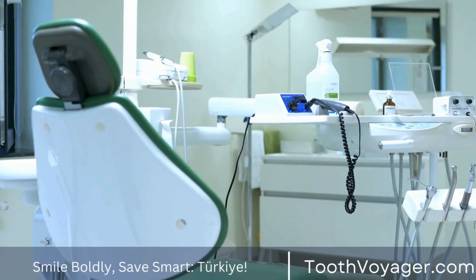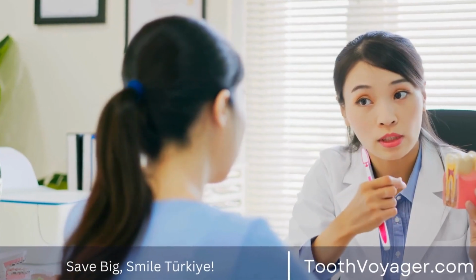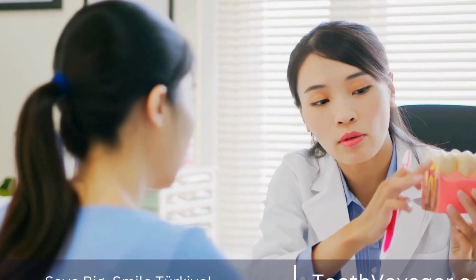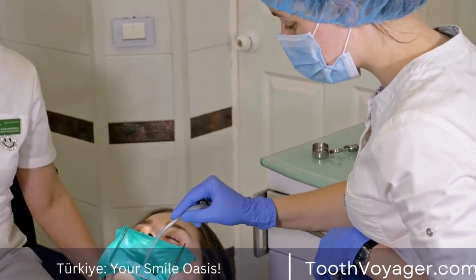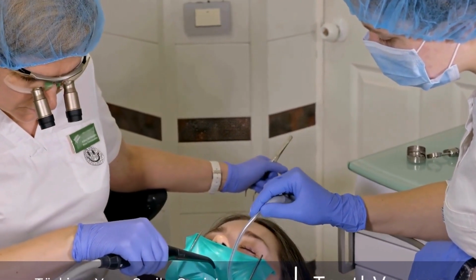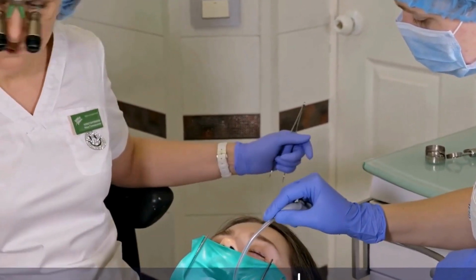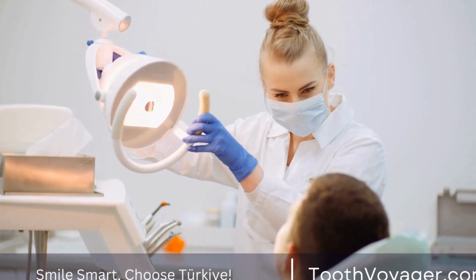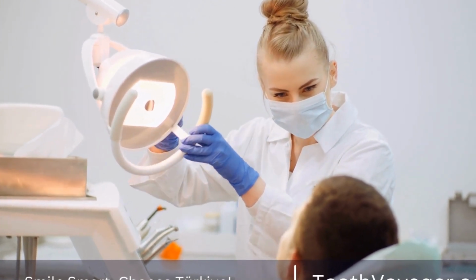Final restoration. Once the period of healing is over, the final crown can be put onto the dental implant. It could involve the attachment of a bridge, crown, or denture to the implant in order to restore functionality and appearance to the smile of the patient. The final dental restoration is made to order for a perfect fitting with the natural gums and teeth.